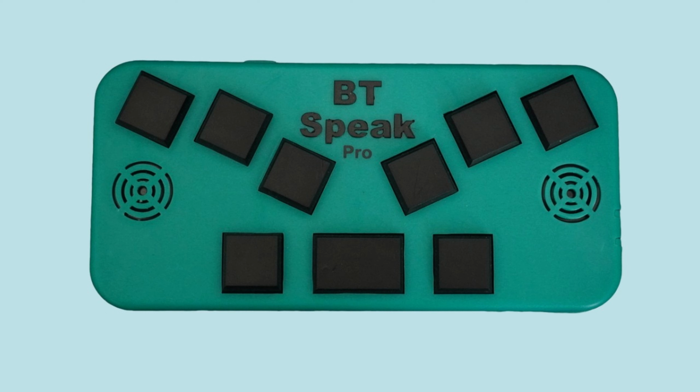So what do I mean by that? Well, if I want to move to the next line, I can press the dot 4 key with the space bar. So I'll do that. Begin reading. It says begin reading. That's a disclaimer from Bookshare. And I'll press it again. Blank. Blank. 2 things were certain every Saturday. Growing up. Pancakes 4. Breakfast and hiding behind a pillow with you at 7 p.m. Thank you, Mom. Okay, so that was a dedication.